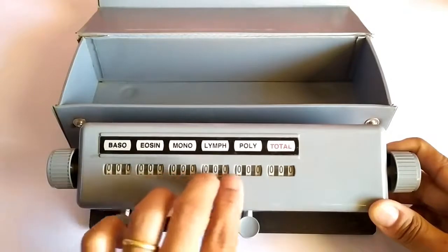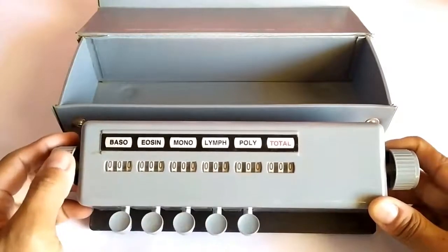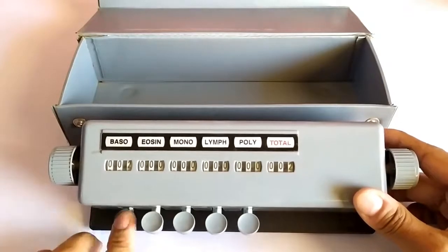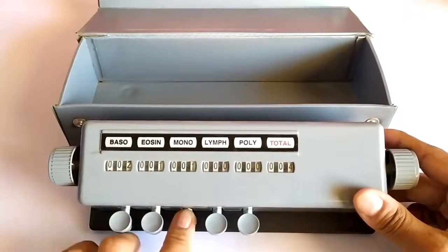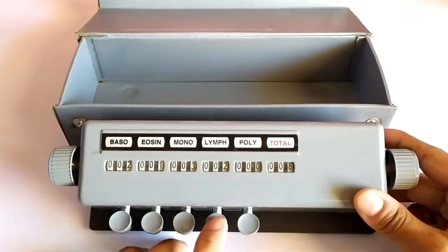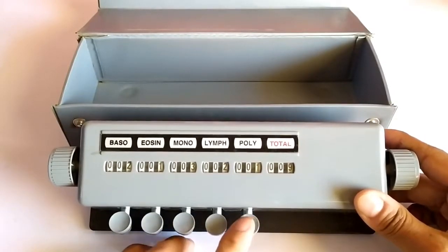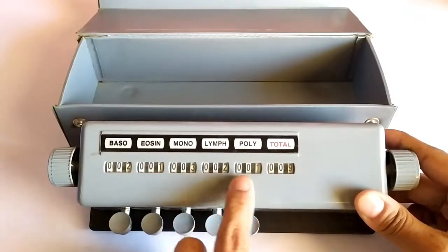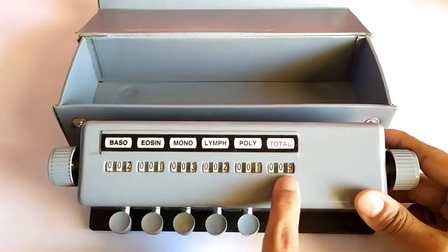Each slot contains 3 rotating numeral rings from 0 to 9. Numbers are updated and entered into the rotating numeral rings of each of the 5 slots using the 5 keys, which look pretty much like the keys of a typewriter. To use this cell counter, all you have to do is press the key of that slot for the particular cell type. One single press for one cell count.